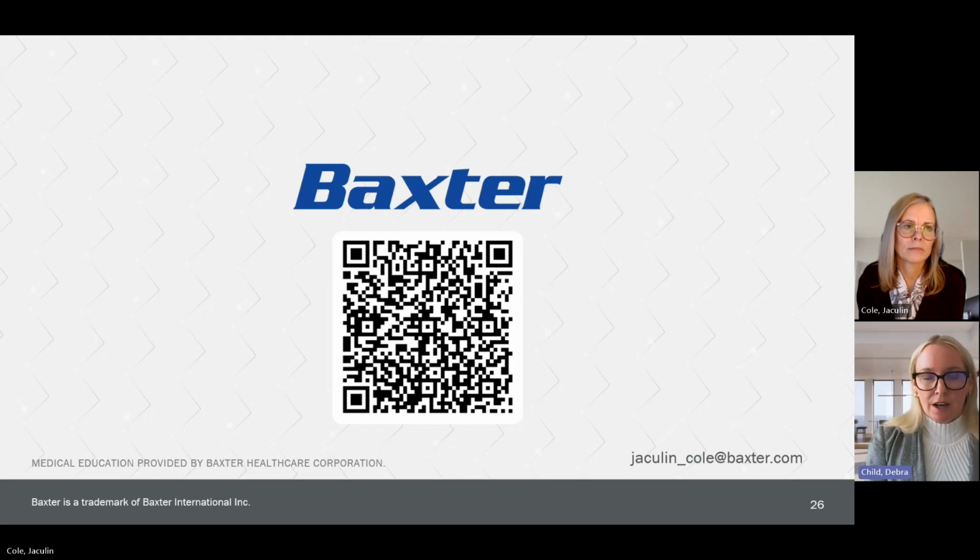Those are great ideas. Of course, you may want to reach out to your drug library pharmacist. Maybe there are some optimization settings that can be done within the pumps. And then, as you're collecting those characterized syringes, as you described, Jackie, try to make sure those are prioritized for the most critical infusions. That would be another suggestion I might have.